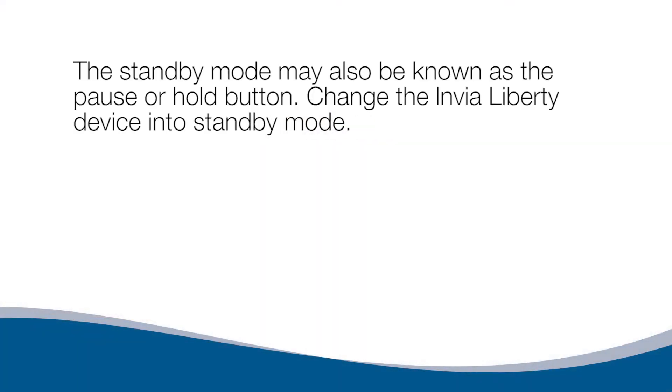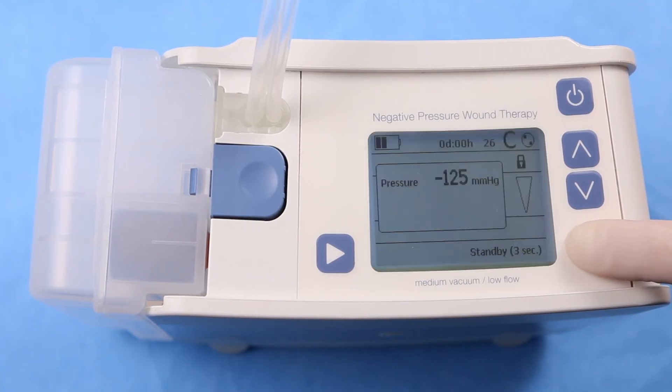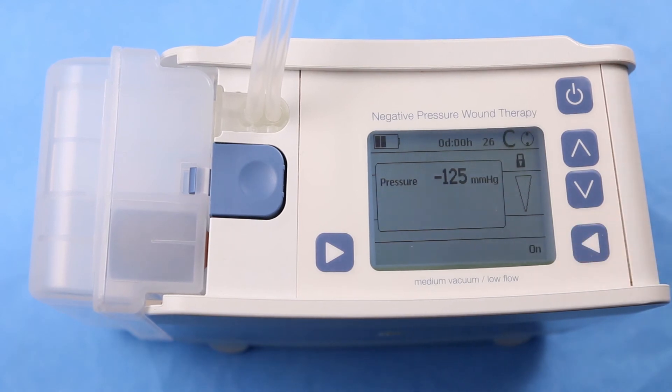Standby Mode. The standby mode may also be known as the pause or hold button. To change the Envia Liberty device into standby mode, press the standby button for three seconds and the motor will stop running. The run indicator will also stop. If the device is in standby mode for longer than five minutes, an alarm will sound and the display will read 'Pump in standby mode.'